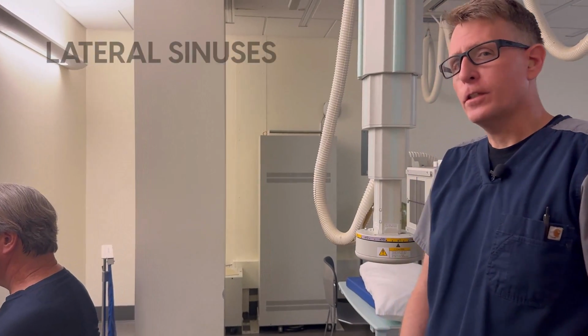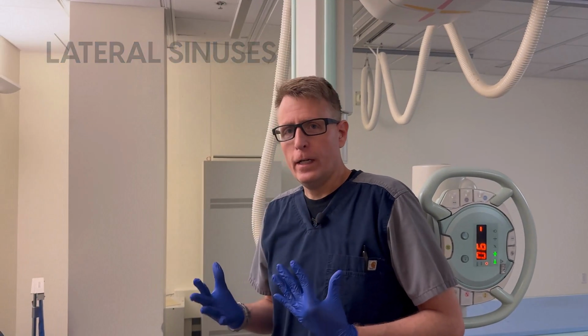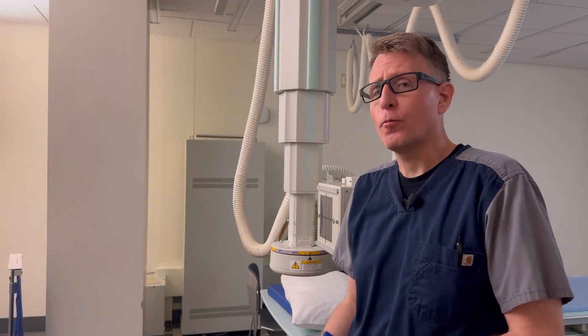For a lateral projection of the sinuses, you need to ask your patient if there's one side that they have trouble on versus the other. And if they don't, then you can do whichever lateral you want. But if they have more issues, say on the right side, you're going to want to give the radiologist a right lateral, which is what we're going to show here.